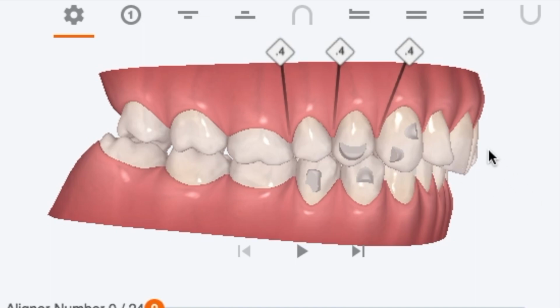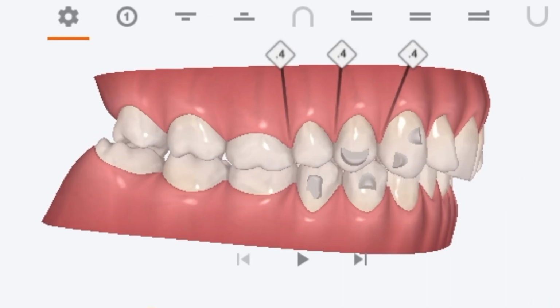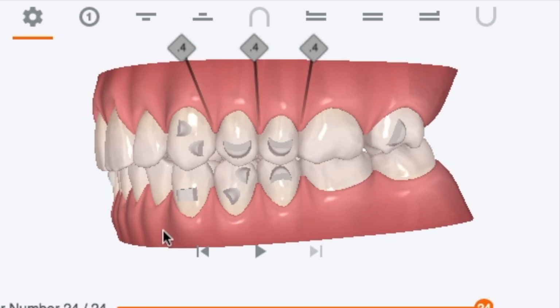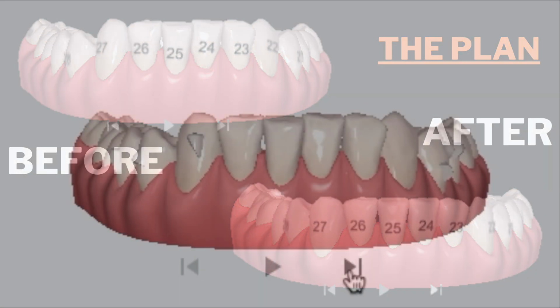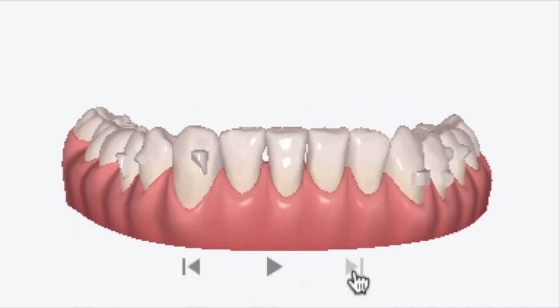But when you look at the video, from the first tray to the very last tray, I think that's when it's really noticeable. They just changed the alignment of the teeth and they were able to move the lower teeth forward a little bit so that the molars were no longer crowded. Boom! Now in the lower teeth only view, you can see that there's like this weird separation between the front teeth and the molars. When you look at the video, it's super, super noticeable. It's like they're all living in separate houses and then they all move in together.